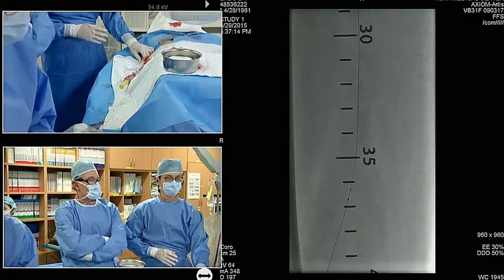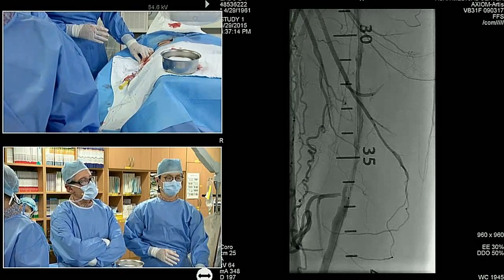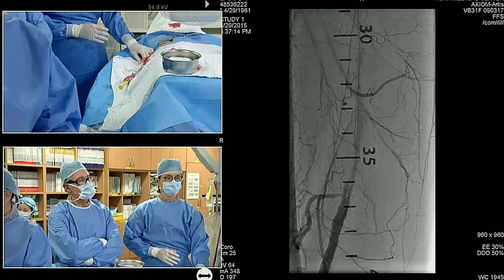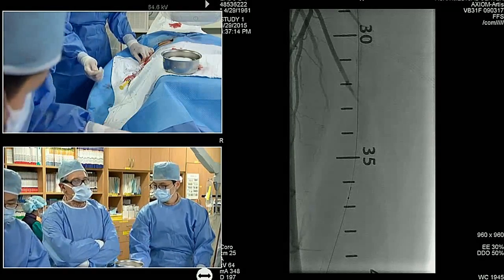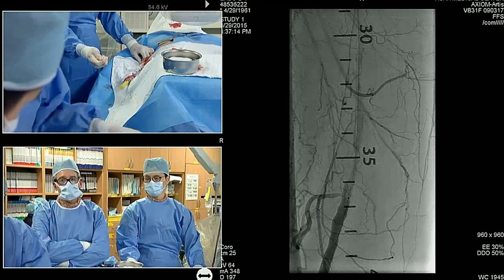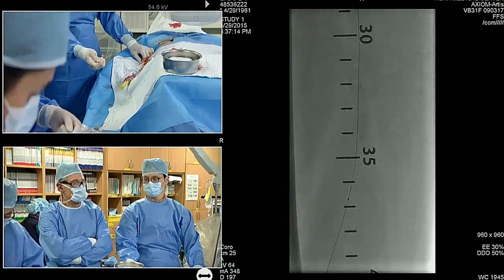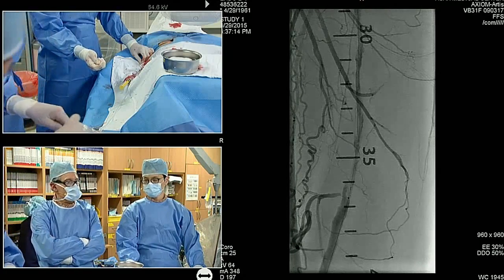Great. So Bob, if this doesn't look any better, what's your choice of stent going to be? Well, ideally, I would use PTX Silver or Viabahn because this is a 30-plus centimeter occlusion. I mean, it's a TASC D. I showed the data on that earlier this morning.